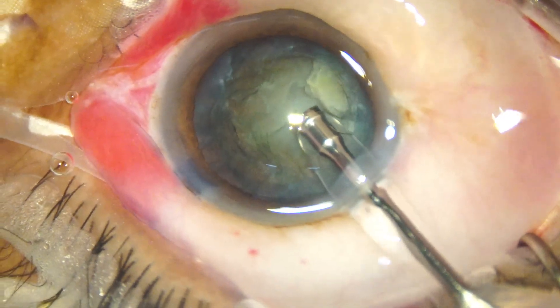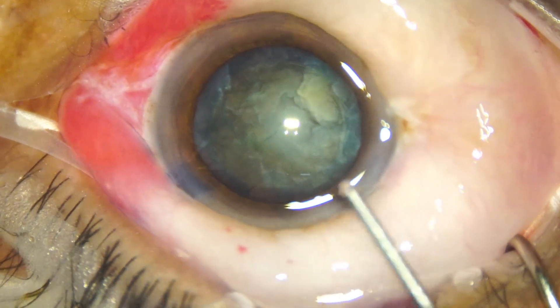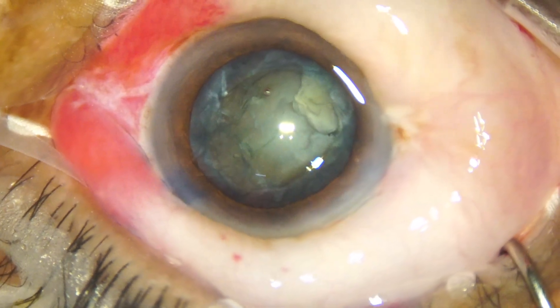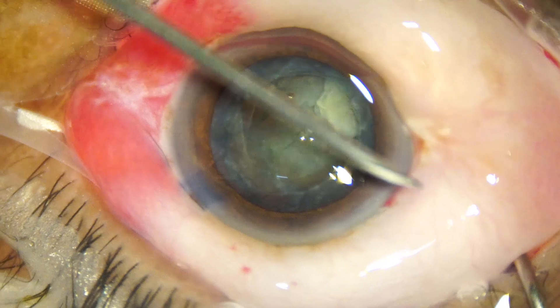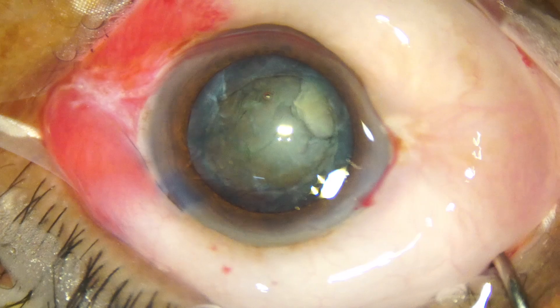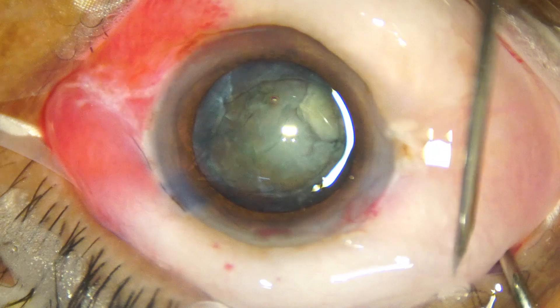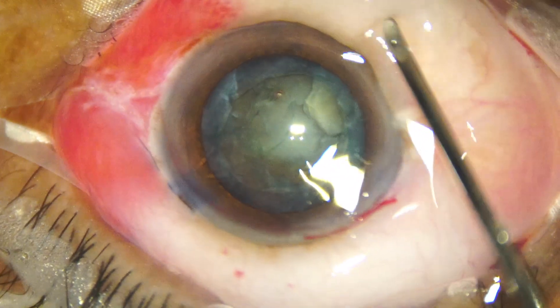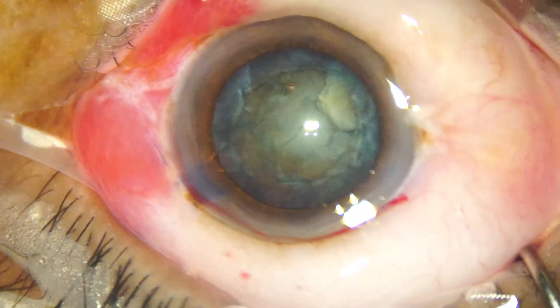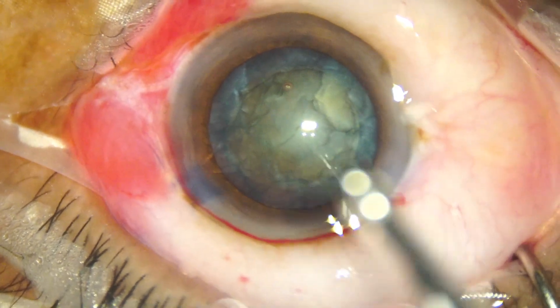She tries to hold it at another place, but by this time the conjunctiva has swelled enough. When this happens, one way is to do a small peritomy. Another way is to do small punctures in the swollen conjunctiva. This is a sharp 20-gauge needle and she is making some small punctures in the conjunctiva. This swollen conjunctiva can cause some disturbance in visibility, so it is better to do something about it, particularly for beginners.